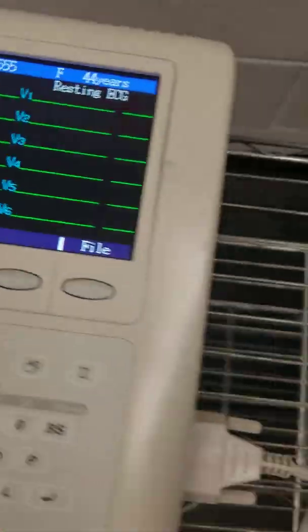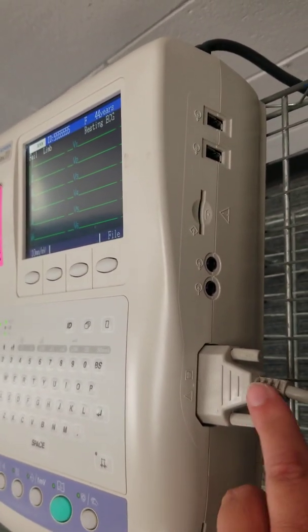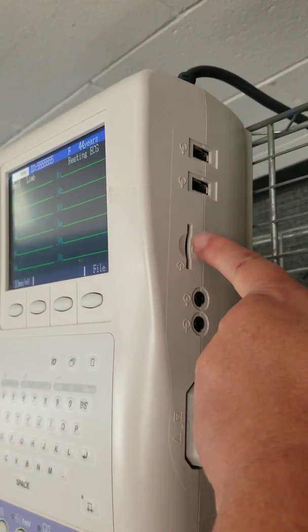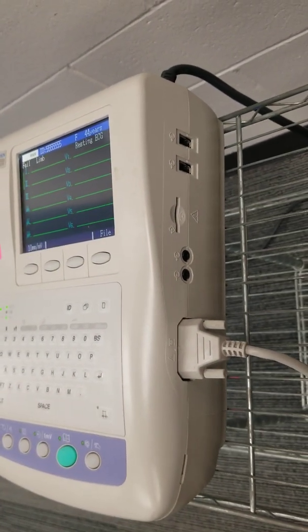On the other side, this is where my limb leads and chest leads plug in, as well as a spot for an SD card. We are not going to be using this, but it does allow us to store things externally if we choose to.